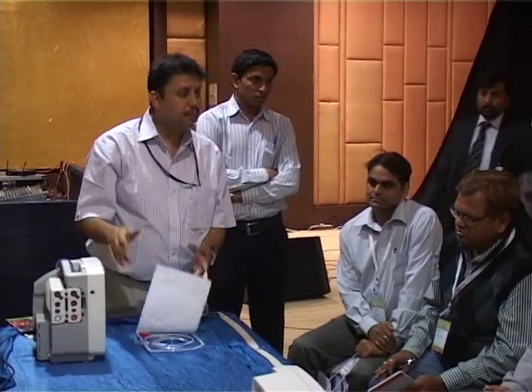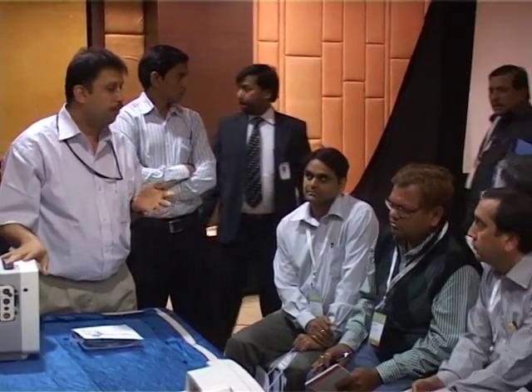Now, since this is a minimally invasive technique, if you are referring to the previous technique like Swan-Ganz, that is where you have to insert it.